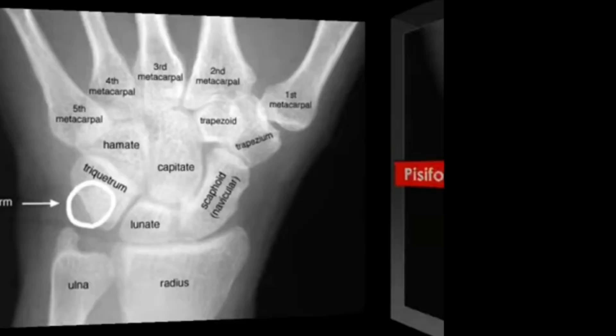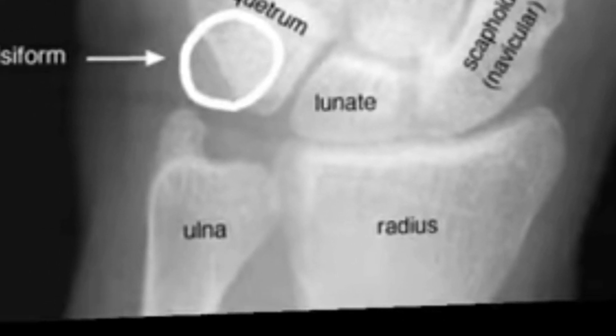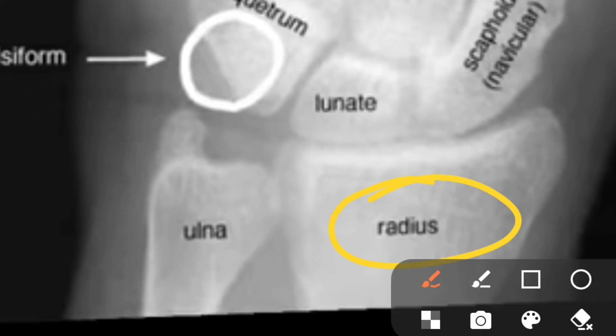You can see here — this is the radius, lower end of the radius, lower end of the ulna.